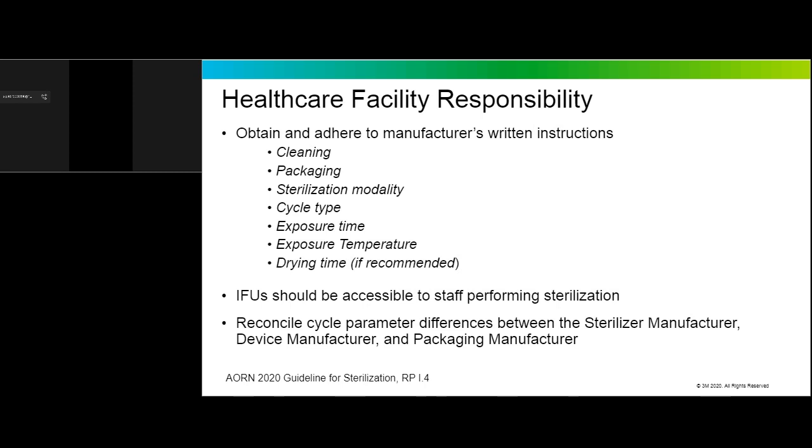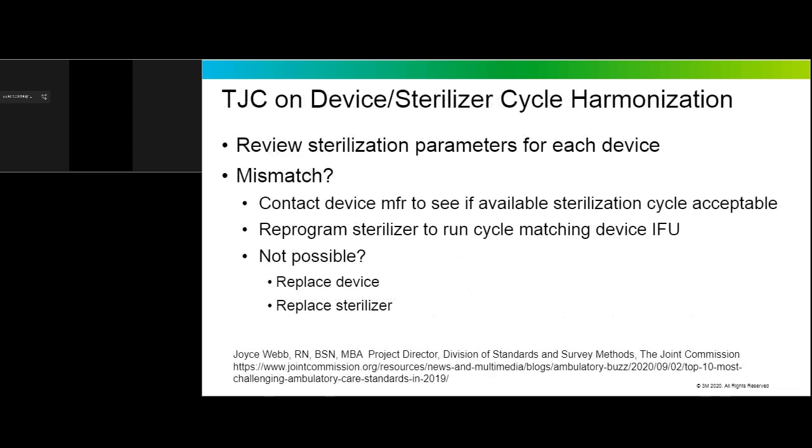Now the tricky part, and I truly feel sorry for you guys on the front lines having to deal with this, but AORN does say that if you have a conflict between the device, sterilizer, and perhaps packaging IFU, it's on you as the end user to reconcile that difference. So I understand that this is truly a burden and does require some legwork. And our survey bodies also understand that.